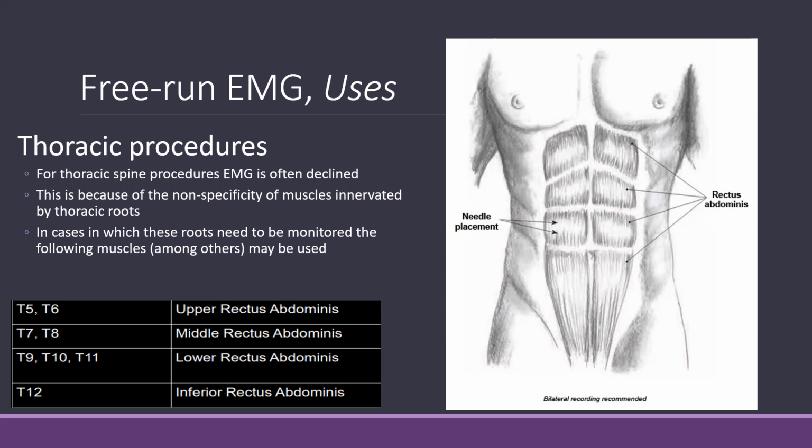Other muscles like intercostal and oblique muscles may be used. However, these muscles are deeper and would require longer needles. And then there would be even less specificity because you may also get activity from the more surface muscles.